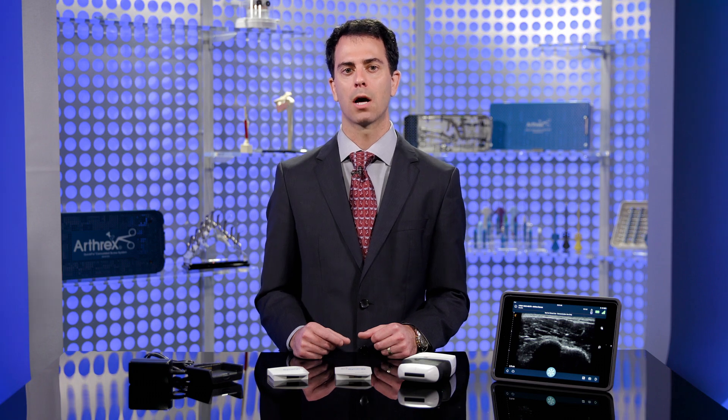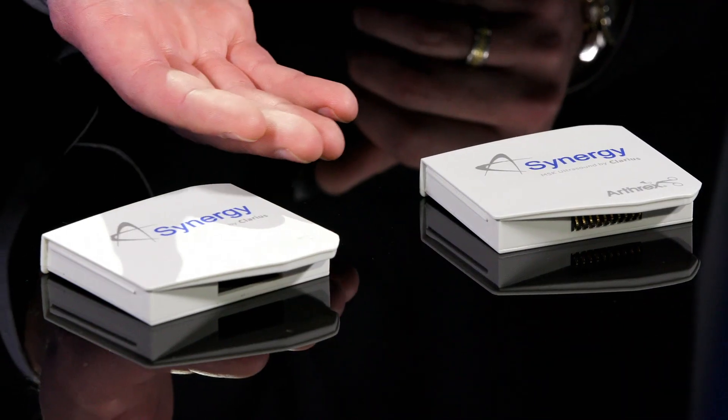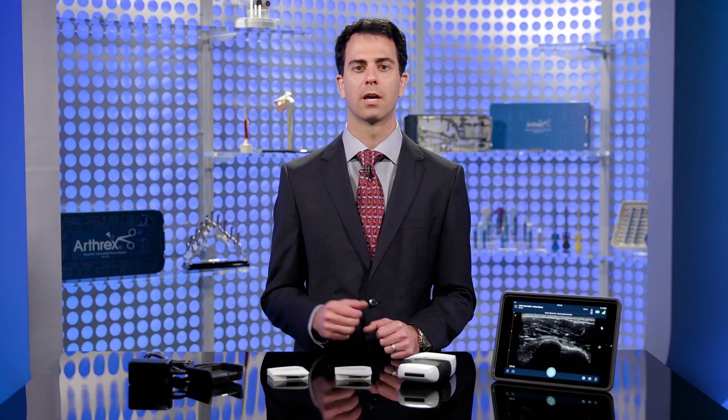Each system comes with an ultrasound scanner, two rechargeable lithium-ion batteries, and a charger for all-day use.